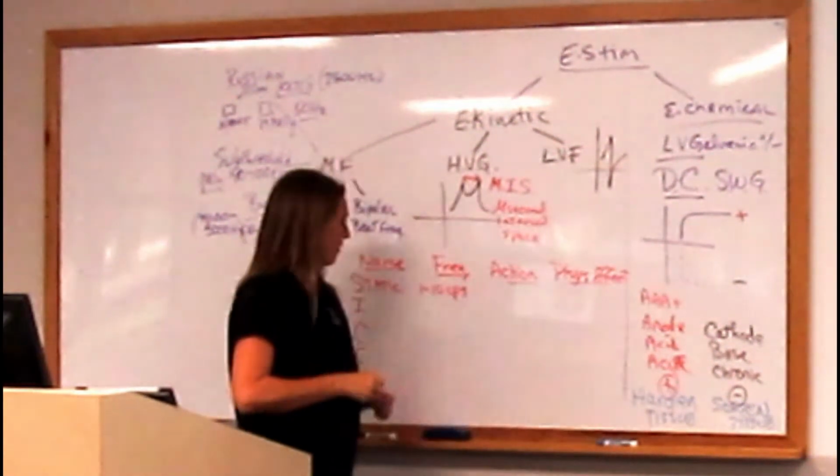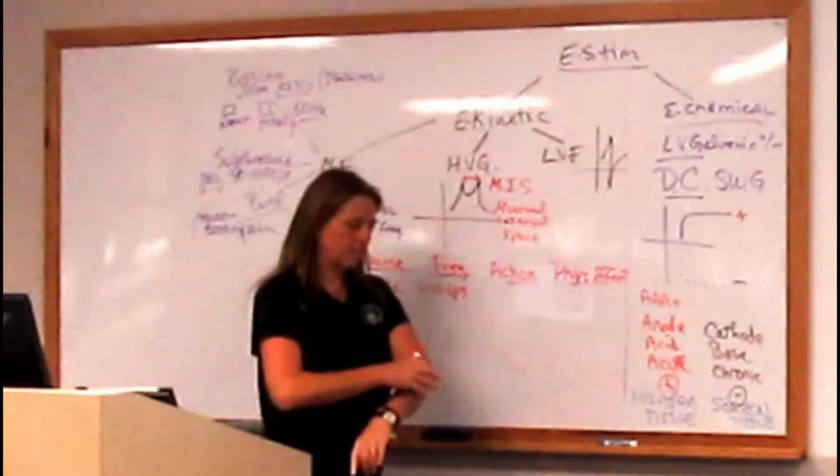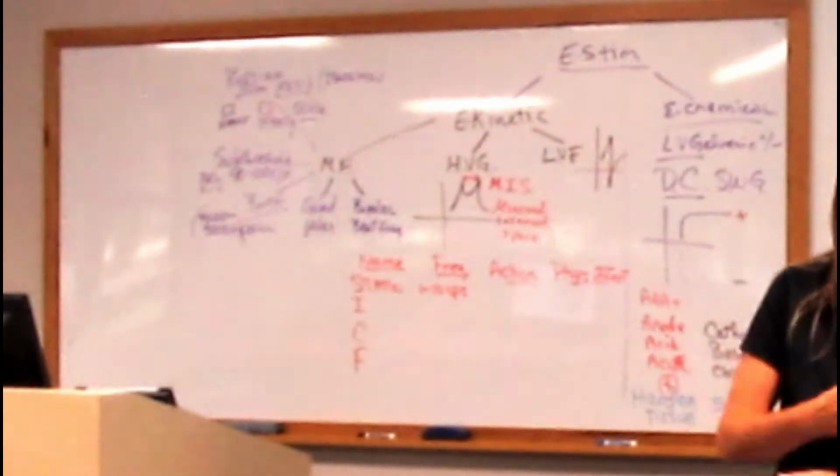Okay? Now, the question is, what does the static do at 1 cycle per second? That's kind of like doing this. Doesn't that look a lot like doing myofascial adhesion trigger point work?